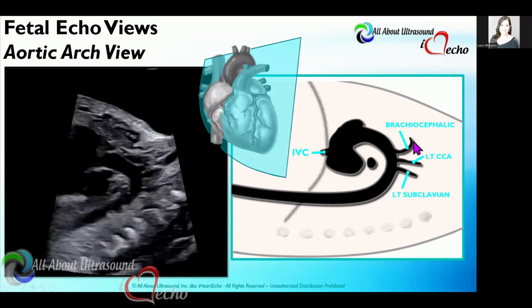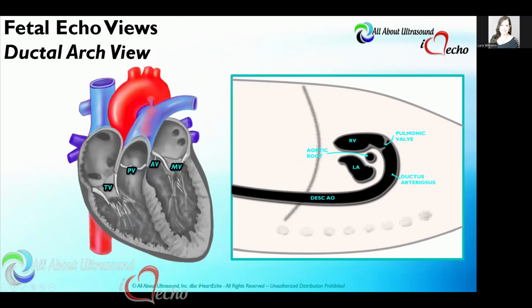The biggest thing to look for, again, is those head and neck vessels. They may be different depending on what anatomy is happening and if there are any congenital heart defects going on. These might be a little varied, right? But having head and neck vessels there is really going to set that apart from this view. And that helps us understand the difference between the two.